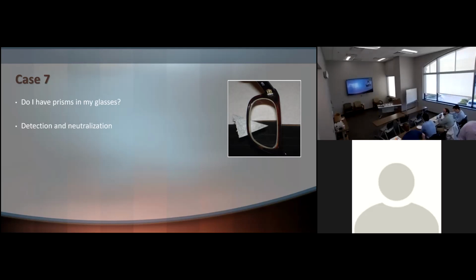But there's a sweet spot on the line. With prism glasses, you do not see this sweet spot. If you move the glasses across the edge, you're going to still see this displacement. And in order to measure precisely the amount of prismatic effect when the patient is using the glasses, put a small tape or marking pen at the optical center. So put the glasses on and mark the pupil on the lens, and then hold the lens over the table and see how much prismatic effect you have, and to say how much you can hold the prism in the opposite direction.